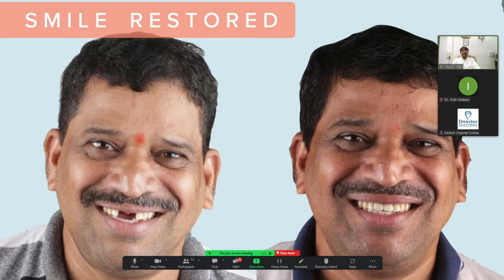Most of the time when I get cases, they are full arches. Okay, we want full arches. Single, we are managing. But single cases also have a lot of challenges. If you plan it, if you see it, you will get the challenge and you can solve it easily. Otherwise you have to face it while you are fabricating the prosthetic.